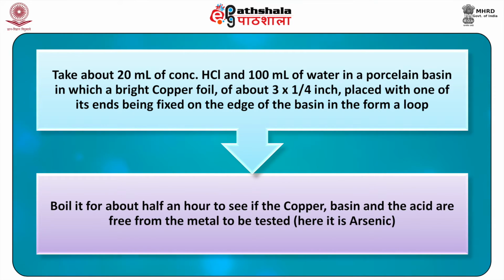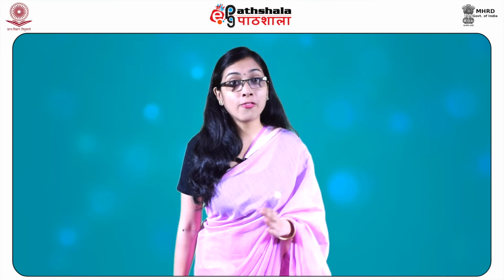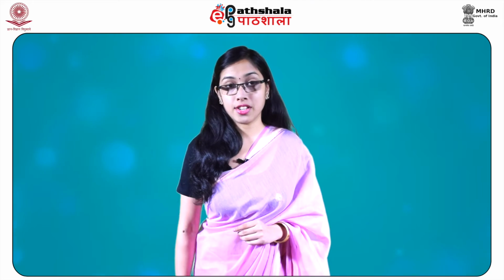It is then boiled for about half an hour to see if the copper foil and the acid are free from the metal that is to be tested. Here it can be arsenic also. If a stain on copper foil appears, the blank experiment is to be carried out again with fresh materials.